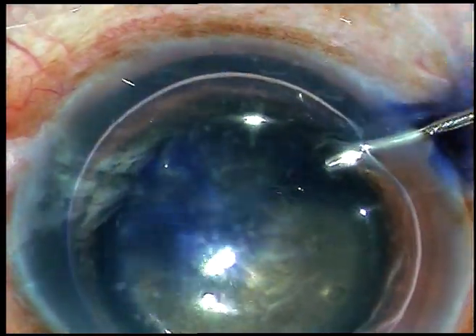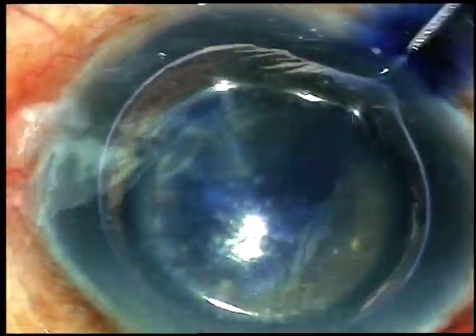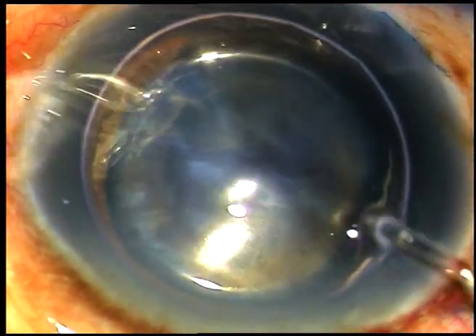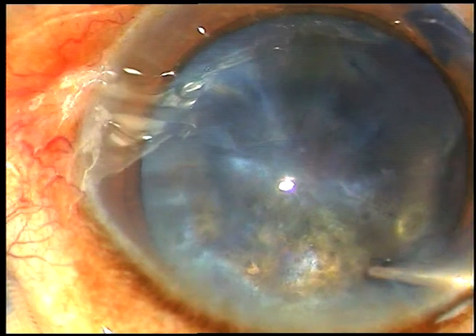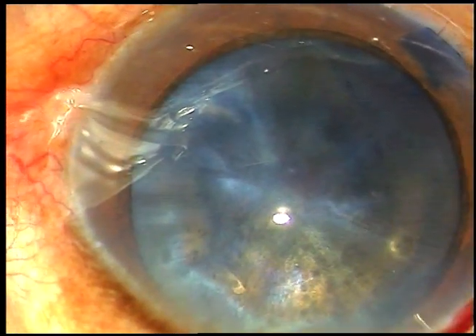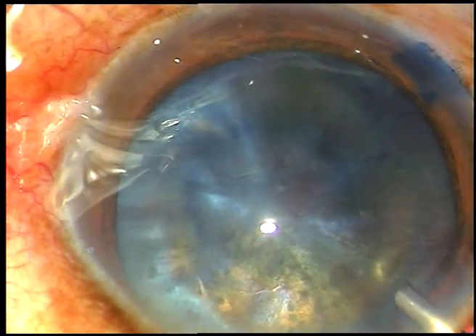An air bubble has been injected. Now, trypan blue dye is being injected under the anterior capsule of the cataractous lens. The dye is washed out. Now, viscoelastic substance — 2% hydroxypropylmethylcellulose — is injected into the anterior chamber.